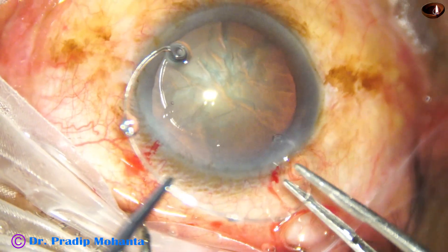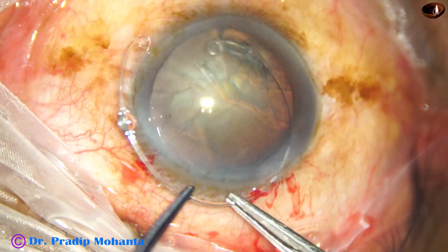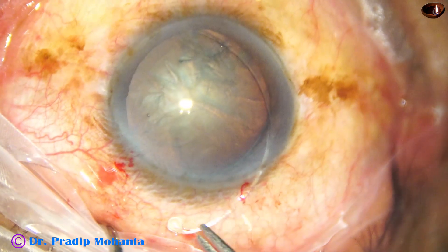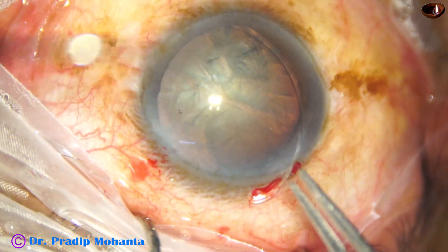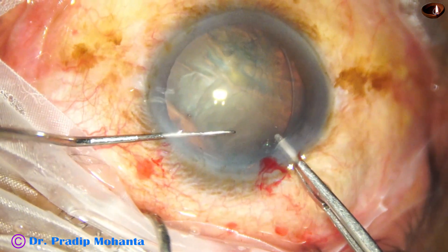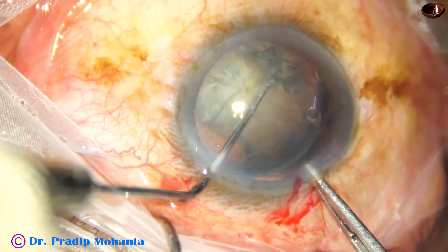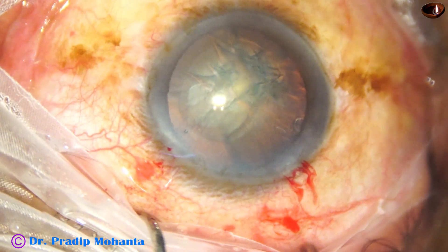Here is the capsular tension ring. The leading end has to go under the rhexis margin. After two or three attempts it has gone under the rhexis margin, and now I am gradually and gently pushing it in. Ideally the CTR should have been placed from a side port at 8 o'clock. The zonular dehiscence appears to extend from 9 o'clock to almost 2 o'clock.